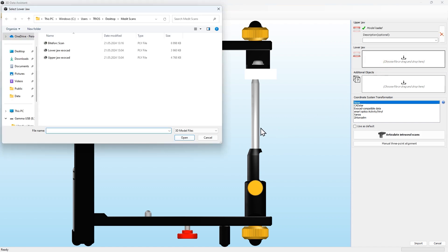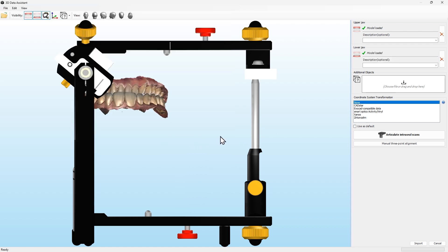When importing these files in Cadius 3D, the software provides you with a step-by-step assistant for articulating the intraoral scans.